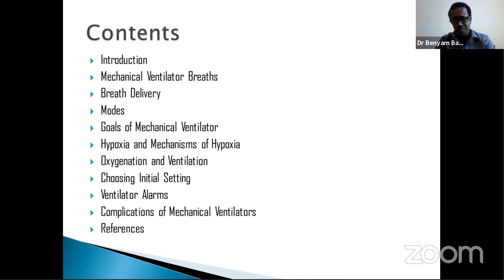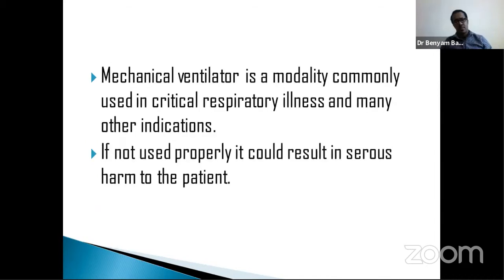So, as an introduction, a mechanical ventilator is a modality or machine that we commonly use for critical respiratory illness and many other indications, including non-respiratory causes. If you don't use the mechanical ventilator properly, as with any other medicine, it will cause serious harm to the patients.